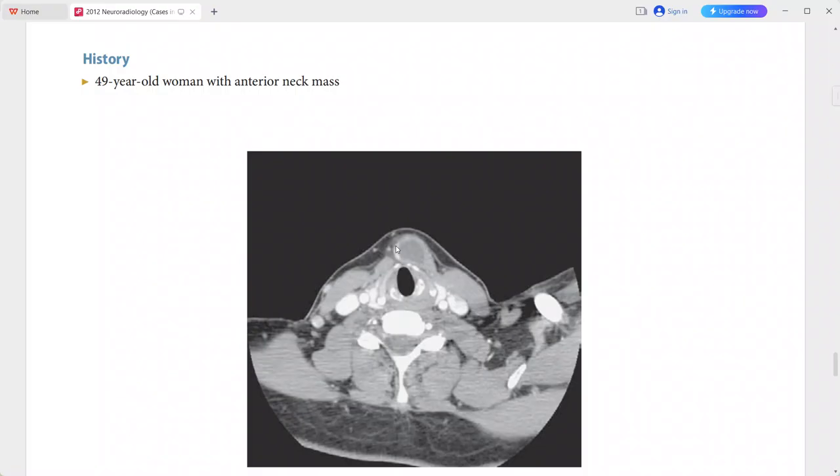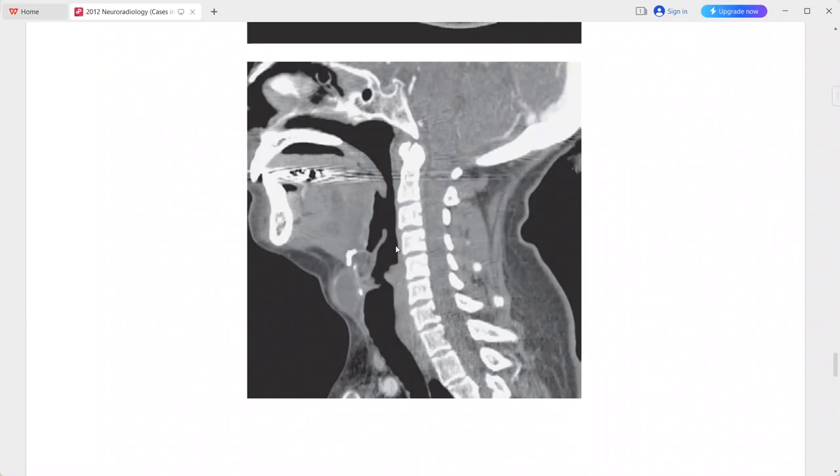This is a case of thyroglossal duct cyst. Differentials include metastatic cancer in a lymph node with papillary thyroid cancer and abscess.